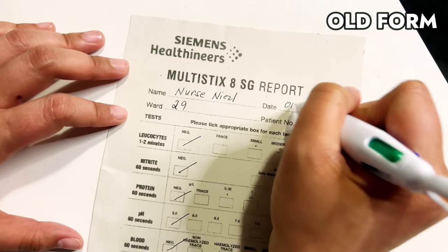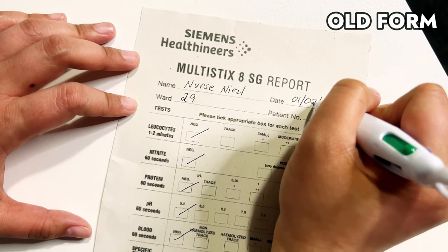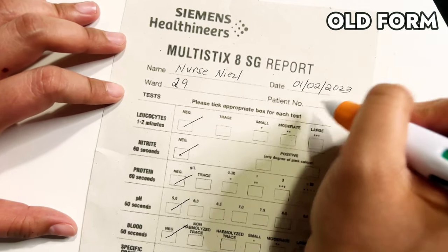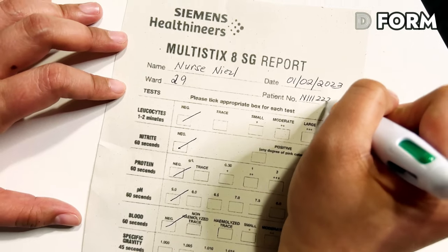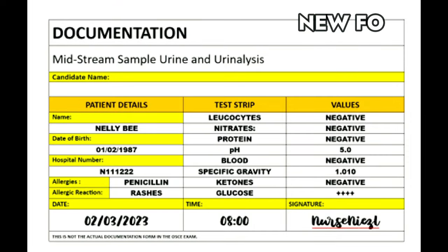You have to complete the documentation, okay? Accurately document on the chart according to the reagent strip. Now, this is just the old form. The recent one or the new form is like this. And this is how you complete this form. We've just finished the documentation.